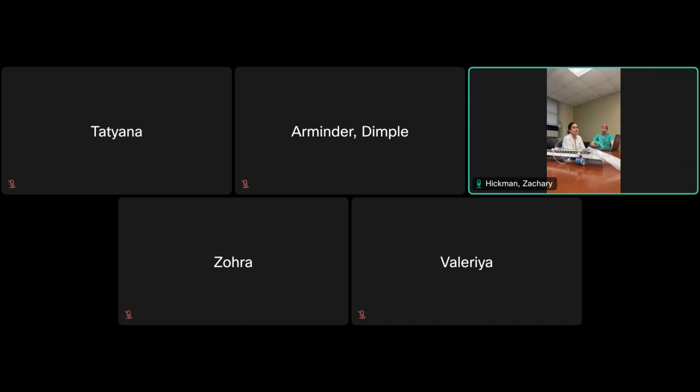So, in which situations would you be going left frontal instead of right frontal? If the left is the one that's entrapped, or if you have, for example, a big ICH or bleed that is going to be in your trajectory from the right side, you want to try to avoid going through that. Or maybe the right lateral ventricle is just too effaced to put a catheter in where you think it's just not going to be functional. But generally we try to avoid the left side, which is more eloquent.